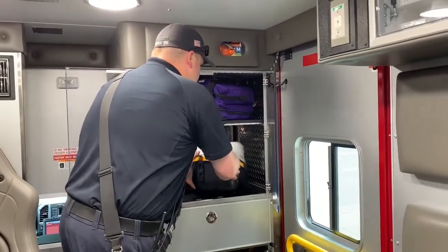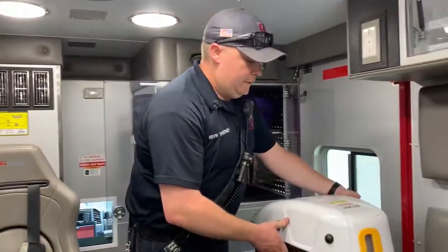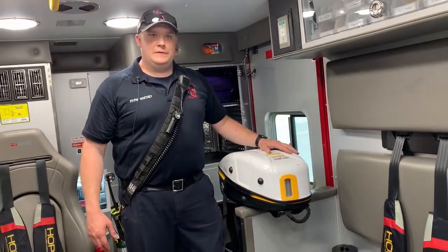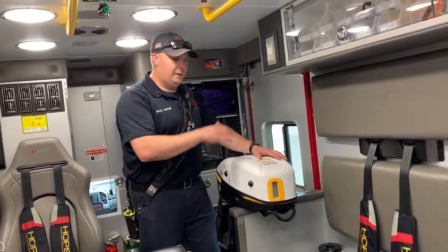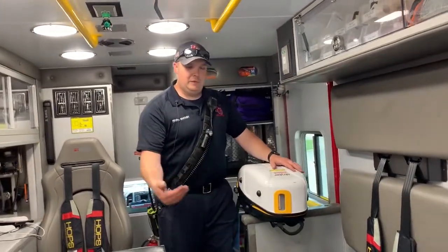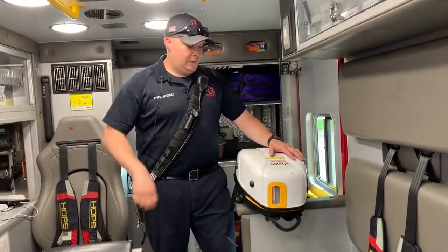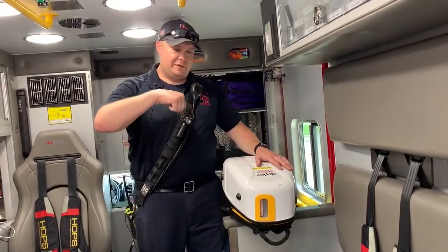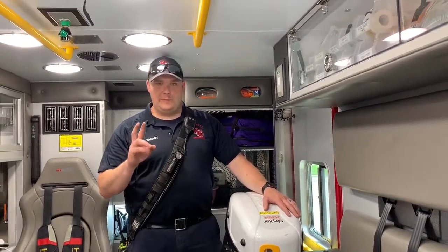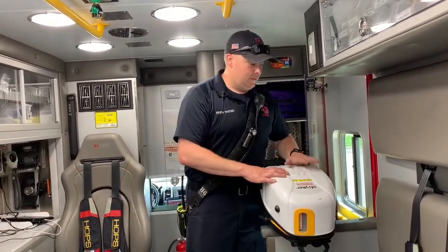Moving around to the front here, we have this device here called Lucas. Lucas is just a brand name. There are many variations of this product out there, but this is called a compression device. So when we're doing CPR on somebody that doesn't have a pulse, we don't have to physically do the compressions anymore. We can bring this out. It comes with a plate that goes underneath the patient, and then the Lucas clicks into that plate on top. And it is a piston that presses on that patient's chest for us. So it frees up, typically we would have 2 people doing compressions. It frees up 2 people to do other more important things. Lucas is our friend.